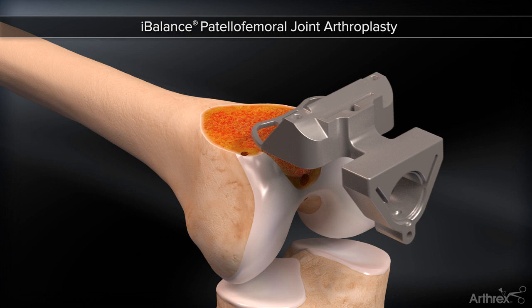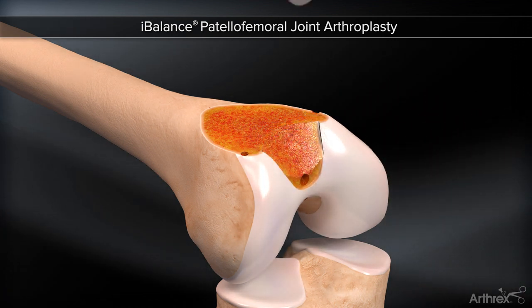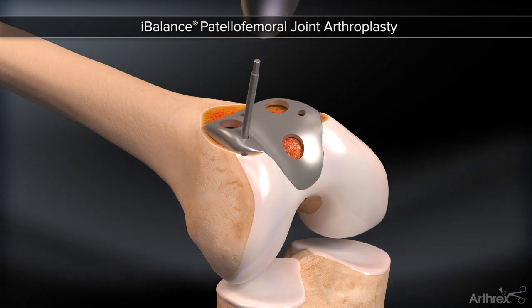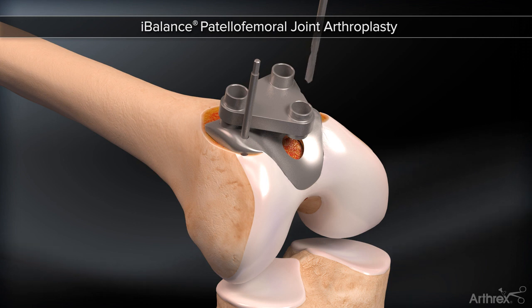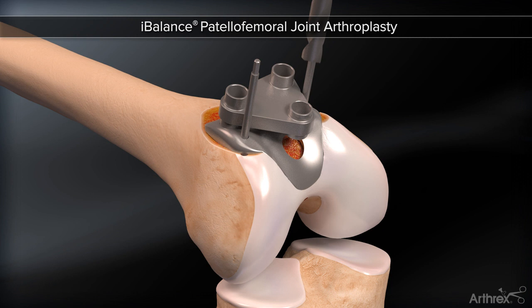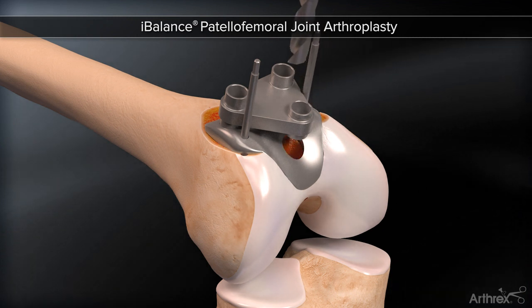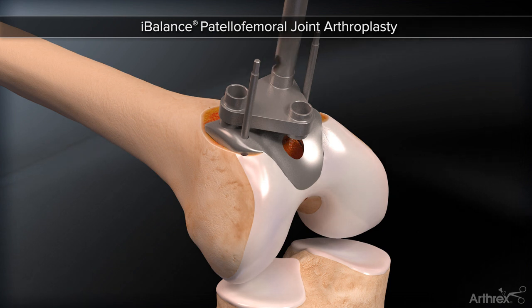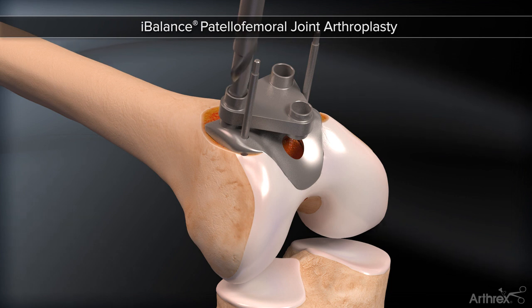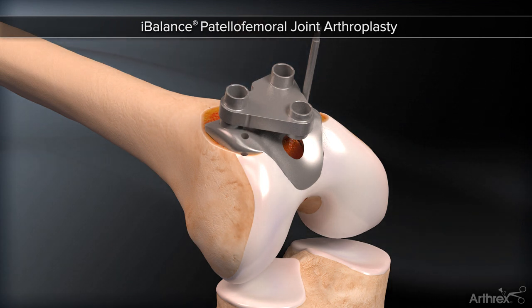The finishing block is removed. A femoral trial is used to test and establish proper transition zones. The trial is pinned laterally. A lug guide is positioned, then pinned medially, ensuring proper fixation. Three lug holes are drilled. The removal of the trial and lug guide may then take place.